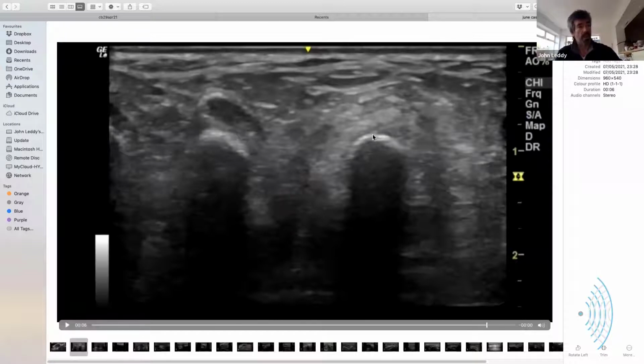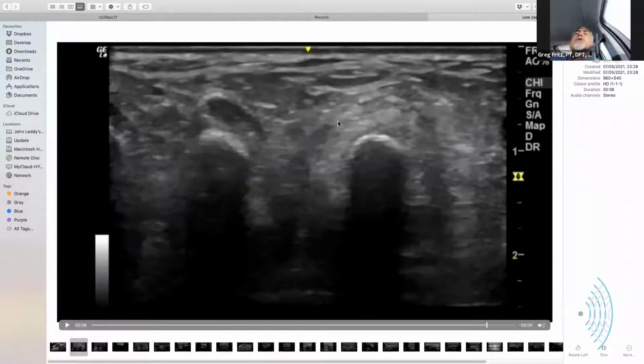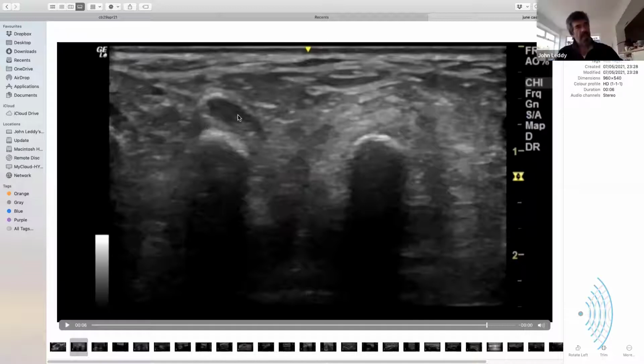And you'd always look at that whenever you look at the circle again, the hyperechoic region you're talking about, that whole area around that, as opposed to on the third one, where we're looking at an actual structure. You said like a lumbrical-like muscle or something like that in that region. Might be a bit of muscle. I think it's just fat that's a different texture. But the things you see around here, you'll sometimes see little bits of muscle, but the fat, you see, that's all very natural, healthy-looking fat there. That is not, and it doesn't look like much.